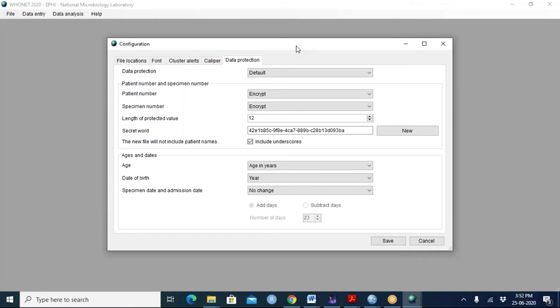But you know the reason why I asked you this question? WHONET gives you many variables that can be used for microbiology. But if I need additional variables, I can create them using WHONET actually. But some people use Excel for their data entry. After they enter the data in Excel, they want to convert that Excel to WHONET. So can we bring all the variables that are found in the Excel into WHONET? Is it possible? All of the variables, you can. Okay. So you do that in BacLink.